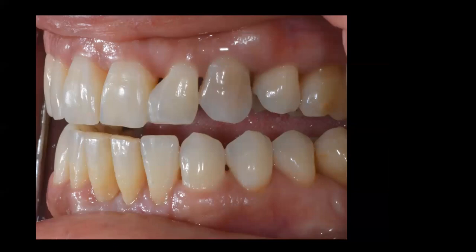Okay. So let me go ahead and say that when I ask dentists, I've shown this case quite a bit. Sometimes dentists say it's the wrong color, right? Some people will say that. And the match there is not great, but color is less of a problem to patients than shape. And that is because of what is called negative space. And so the tooth casts a shadow or a silhouette, and that's what patients see over and over again.